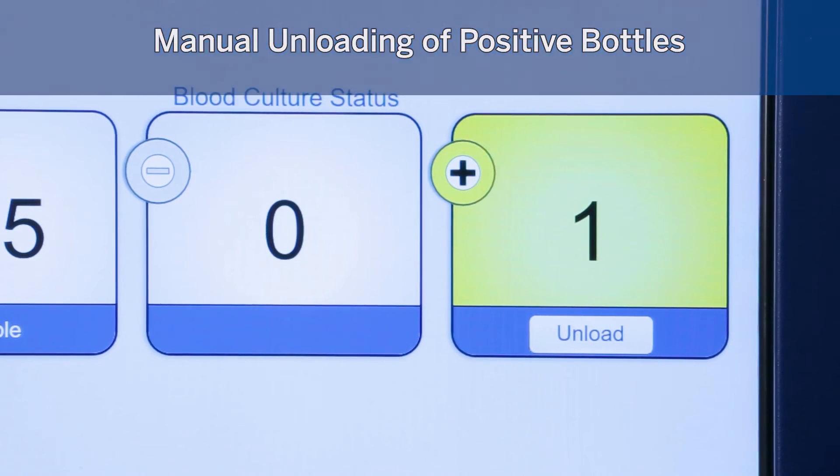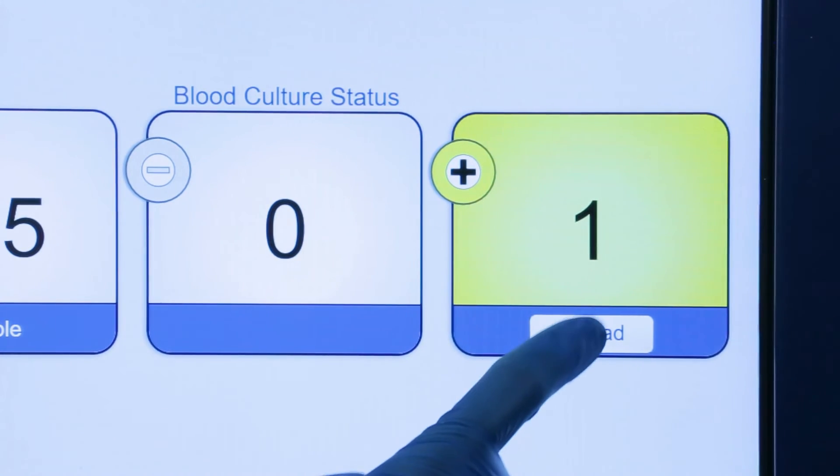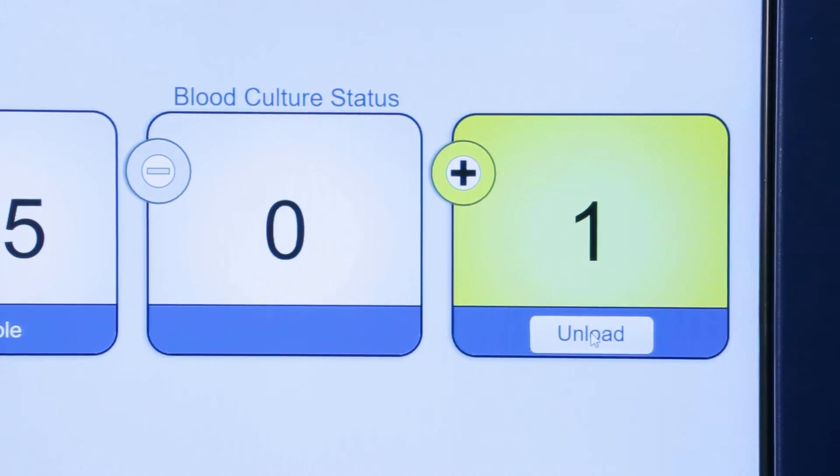Manual unloading of positive bottles: the system can also be configured for manual unloading of bottles. In this case, a user must select the unload button on the screen before bottles will be unloaded to the bottle retrieval area by the robot. Bottles will continue incubating until this occurs.